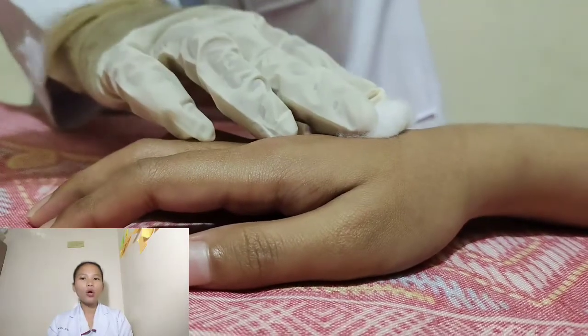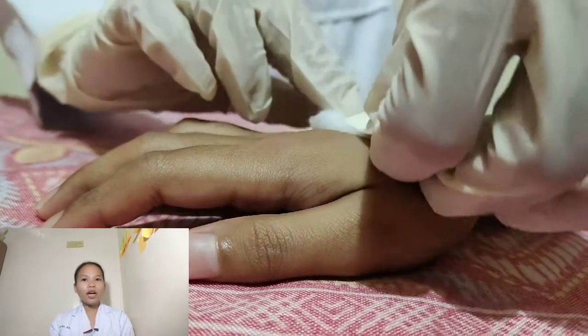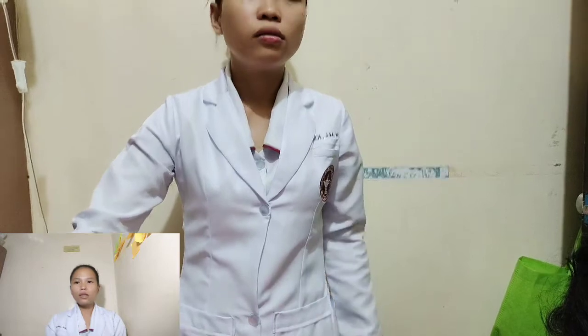Apply the dry cotton ball or band-aid to cover the IV site. The dressing continues the pressure and covers the open area in the skin, preventing infection. Discard used supplies appropriately, remove gloves, and wash hands.